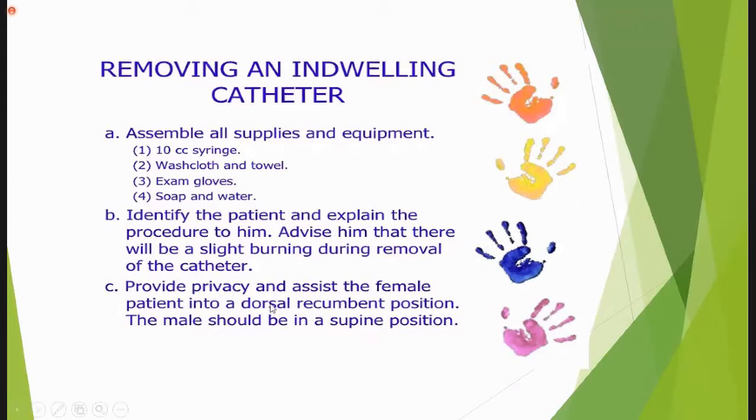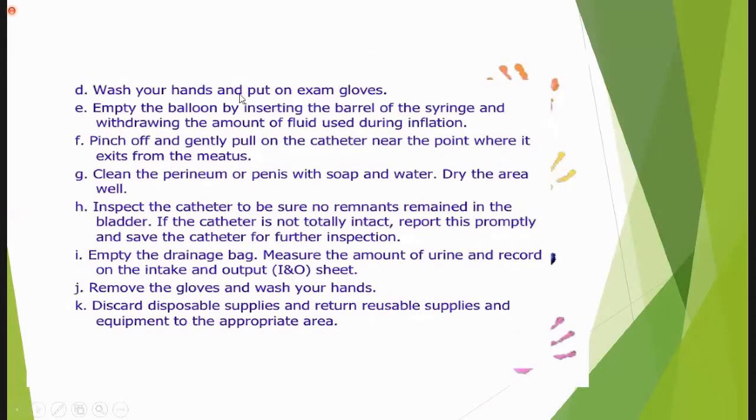If a female patient, which position is this? Dorsal recumbent position. The male should be in a supine position. Okay. Wash your hands and put on the gloves. Examination gloves.